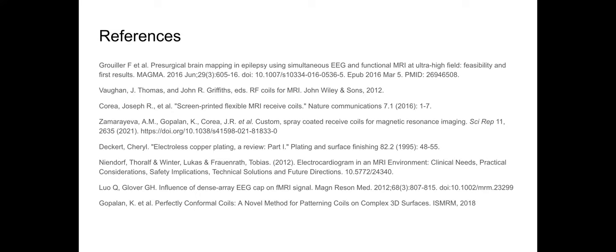So it's generally similar between patients, but because with patients, especially the head, you load it differently every time. What helps you out is that because the Q loaded is kind of small, that means the bandwidth of the coil increases. So any shift in resonance that you get is going to be really small, and you'll still be able to pick up a decent signal as long as you're near 127.7. So even if the resonance frequency shifts from patient to patient, it's still pretty close to what it needs to be. And because the Q is so low, the bandwidth is large enough to accommodate for that.